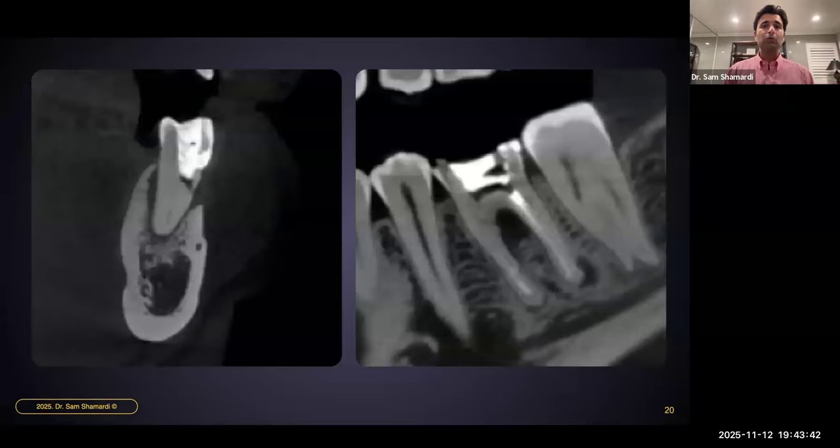And as mentioned, outside of doing it clinically once that tooth is out, in order to plan ahead, 3D technology really helps us do a lot of this work before we even touch that patient. So when we look at some of our CT scans, for example, this image on the left here with that premolar, we know before we've even started the case that there is no buccal plate there. We can see that there's a dehiscence of about the top half or two-thirds of that buccal plate.